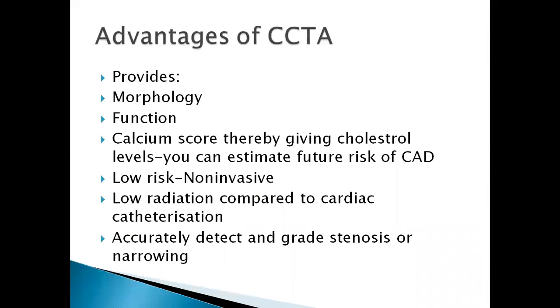So what are the advantages of CCTA? We've seen already that not only will it provide you with more information about the morphology of the heart, the coronary arteries, the valves themselves, the pericardium, the cardiac walls, it's also going to provide you with function. And then calcium score also is obtained.